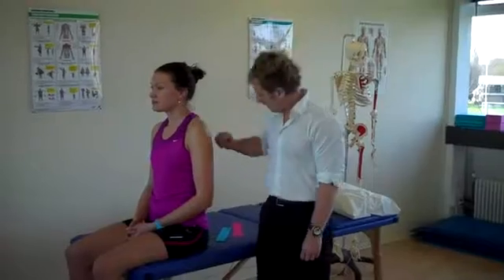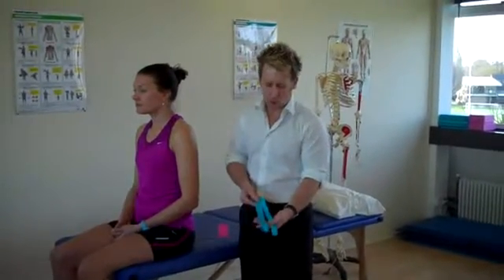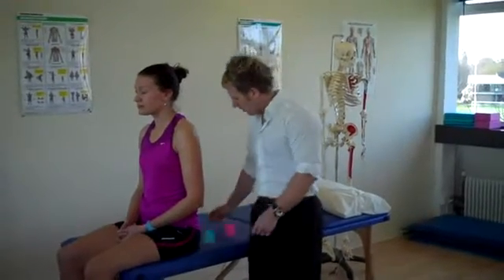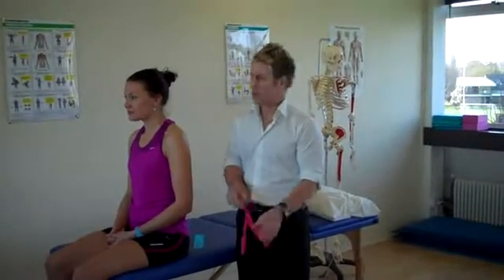The first application of the tape, using a pre-cut eye strip that we've changed into a Y, is going to be used to stabilise the deltoid muscle. The second strip, also a Y strip, is going to be used to stabilise the supraspinatus.